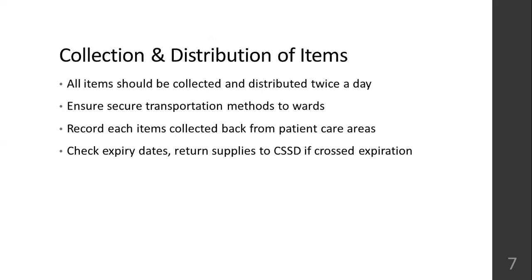Collection and distribution of items. At least twice a day, collection and distribution is done. And on top of it, whenever required, collection and distribution is also done. Okay. But on a routine basis, at least twice a day, collection and distribution is done in CSSD.